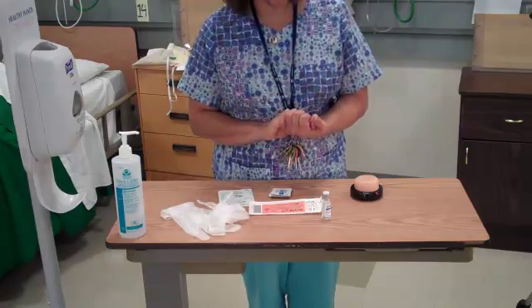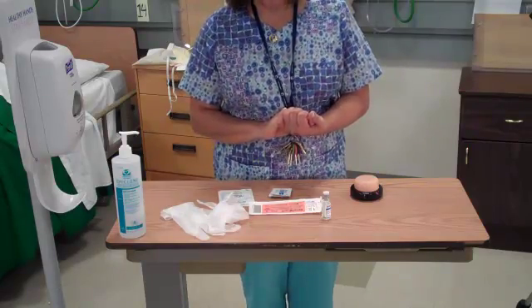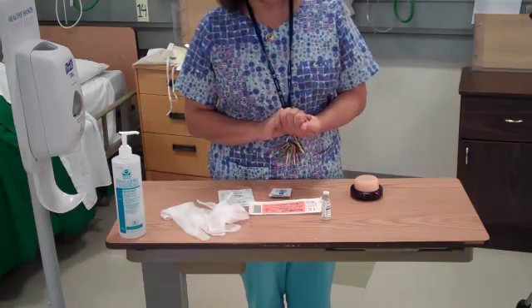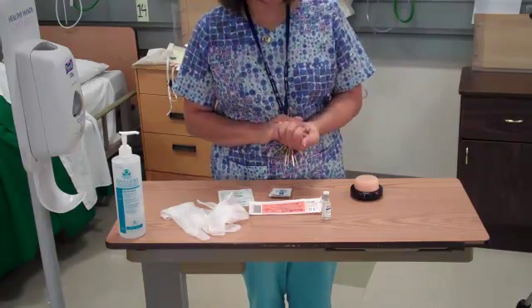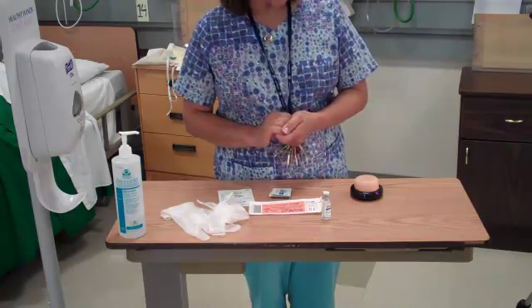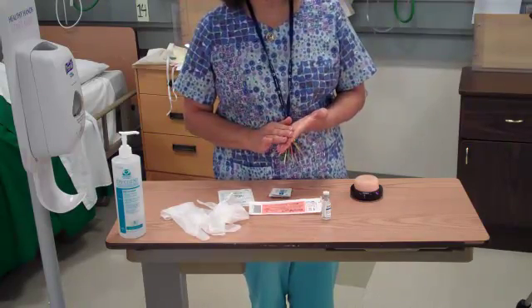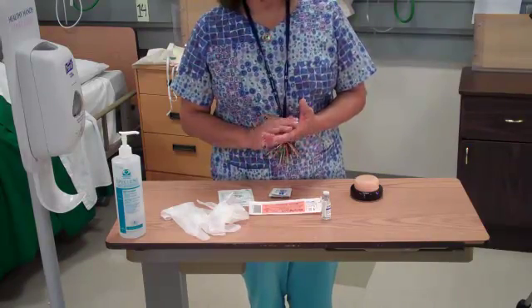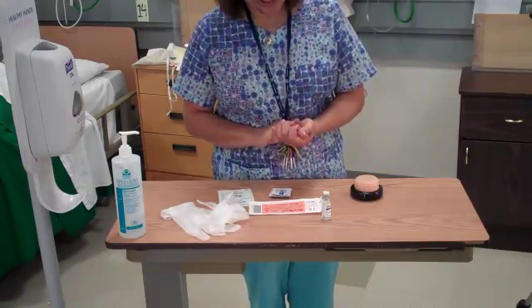Also, you will assess your patient to find the best site for that subcutaneous injection. Most people have better absorption in their abdomen, but you'll have to make sure that there's no rashes, no abrasions, no bruises, or any pain in the area that you'll be injecting.